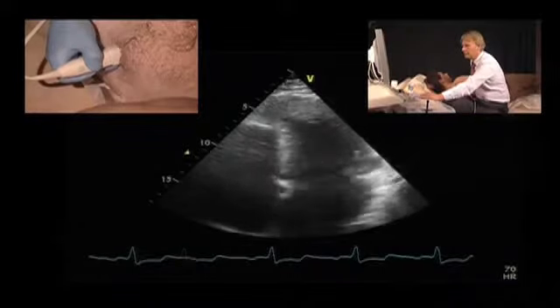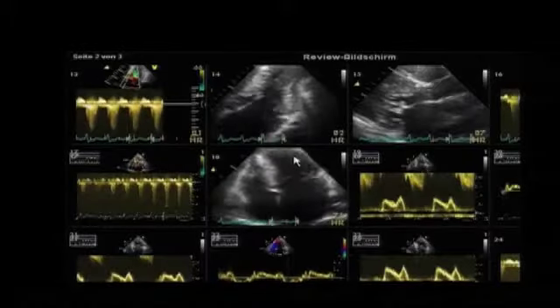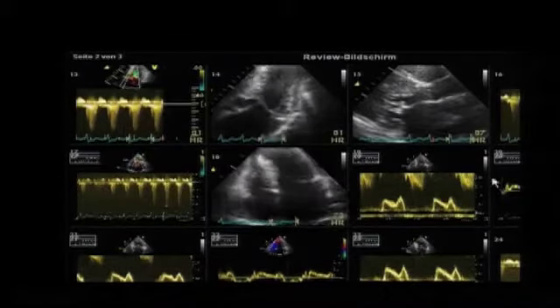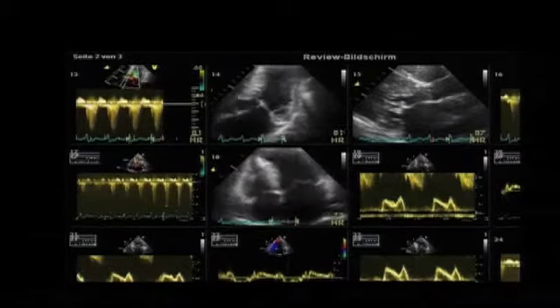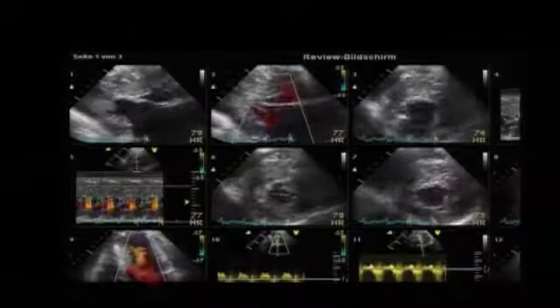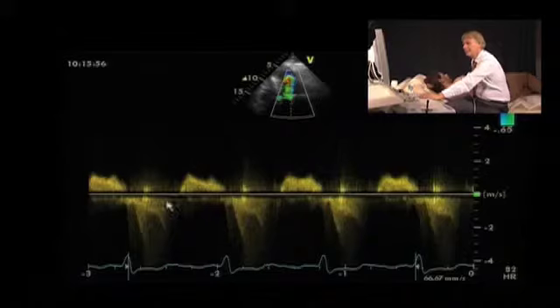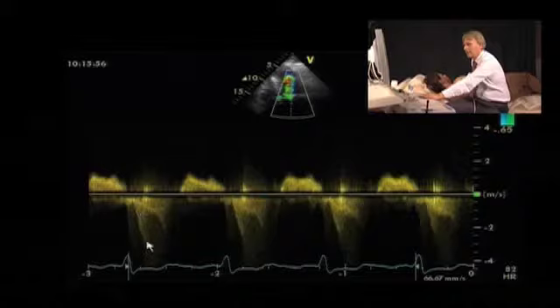And I will show you a signal which displays the regurgitation and also the LVOT velocity. This is this spectrum here. And what you can nicely see here is that we have 3 different spectrums within one. We have the mitral regurgitation spectrum here, which starts very early with the QRS complex. We have the LVOT obstruction, which is here, and we have the midventricular obstruction, which can be seen here.